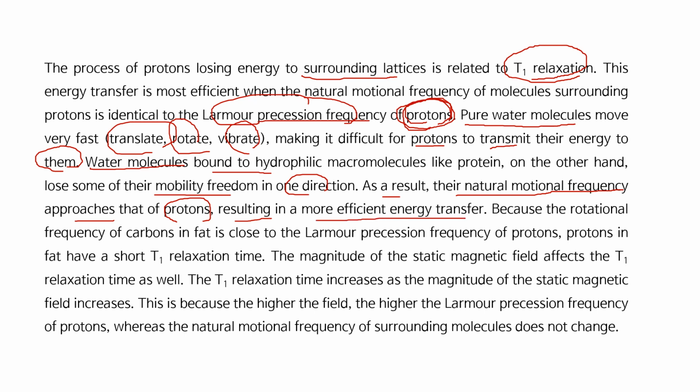So the protons inside the protein can give off their energy to the macromolecules of protein. So relaxation time becomes short.